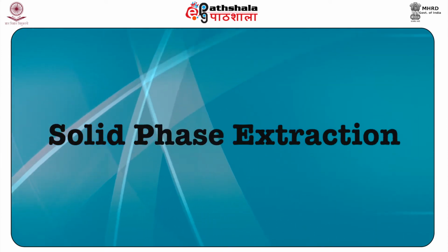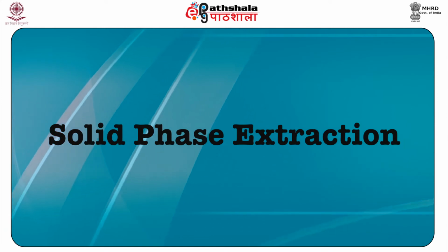Next comes the solid phase extraction process. The old observation in the extraction of drugs by adsorption on solid materials, that is, fluorosil, a synthetic magnesium silicate, or activated charcoal, and the selective elution of solvents thereafter, has given rise to the solid phase extraction method.